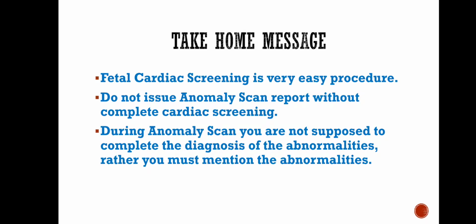Remember, during routine screening, your responsibility is not necessarily to establish the final diagnosis but to recognize and report abnormalities that warrant further evaluation. The fetal heart may be small, but its impact on the future life of a child is enormous. Every careful examination has the potential to change a family's future.